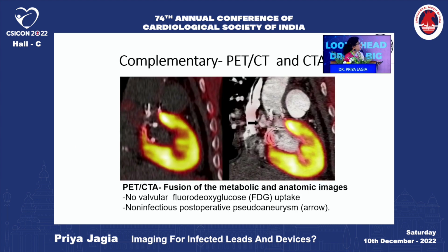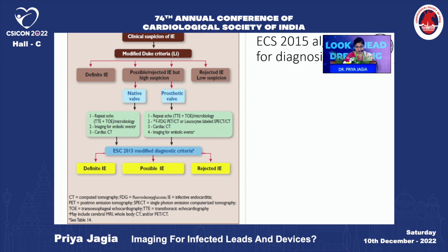So this, you can see, is an aneurysm which was there, but you can see that on the PET there is no enhancement. So this tells us that this aneurysm actually is not infected. So there is a role of complementary PET and CT in certain situations.